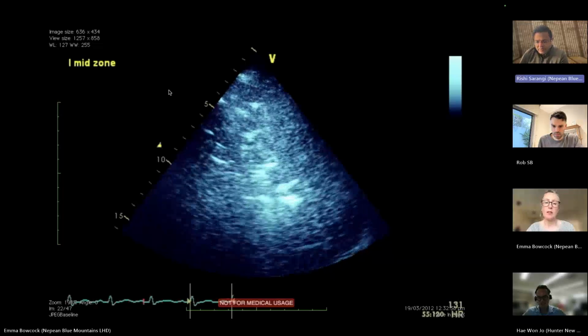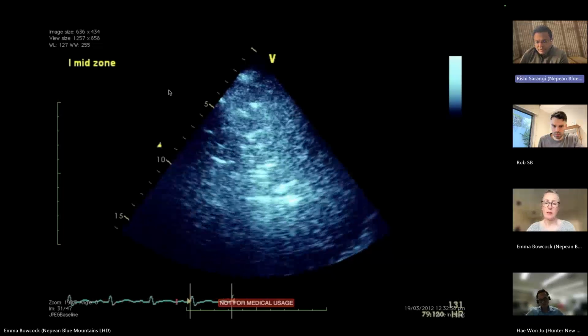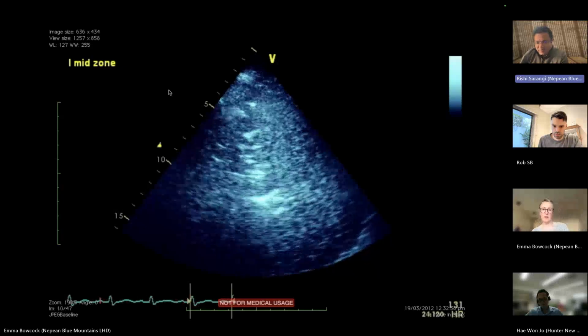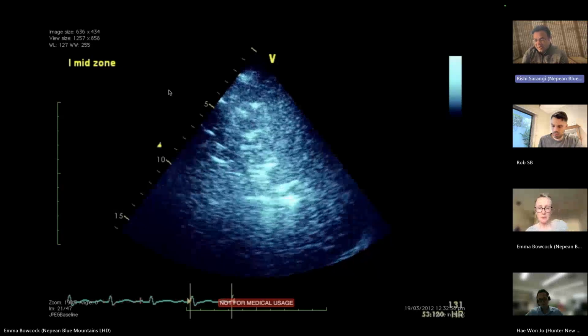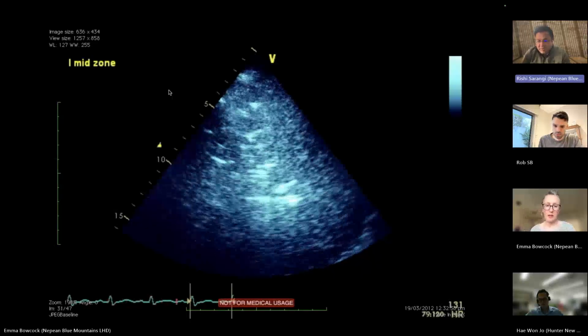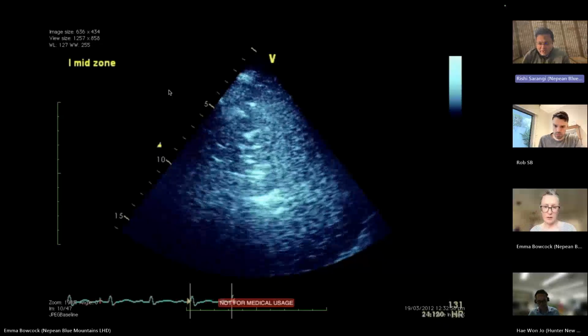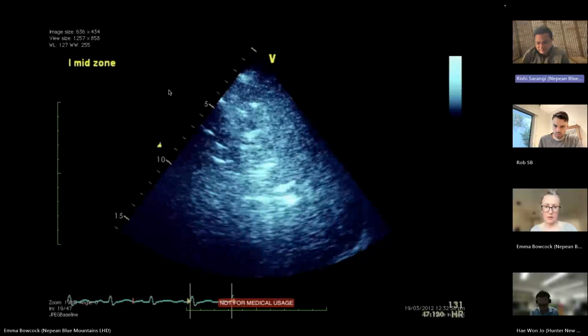A lung ultrasound in the lung midzone, consisting of dense consolidation in the right lung, along with dense irregular consolidation with dynamic air bronchograms. So this is highly suggestive of the pneumonic consolidation process which is going on.